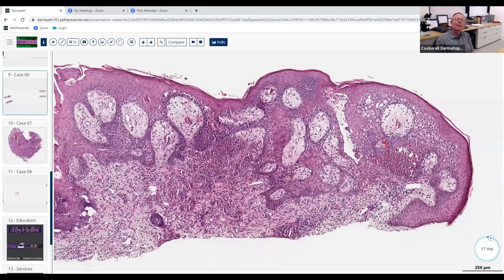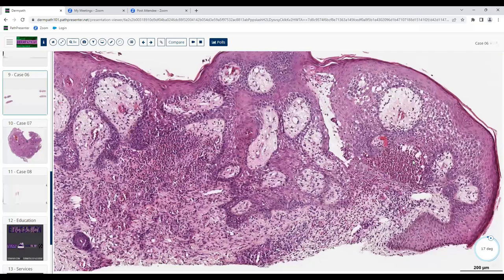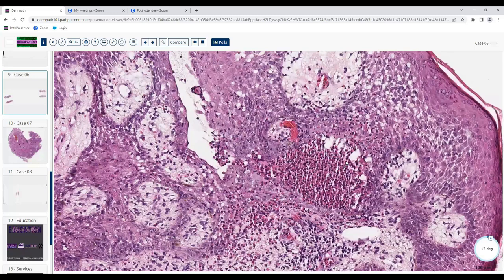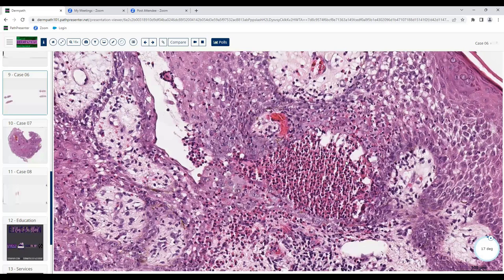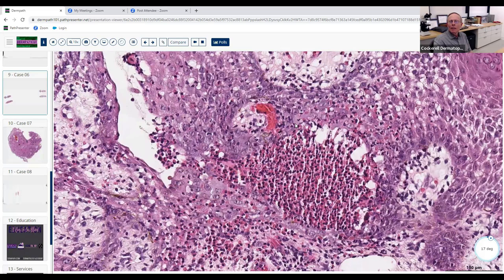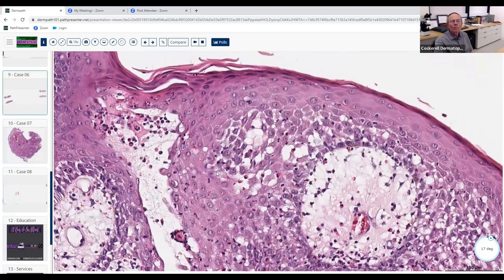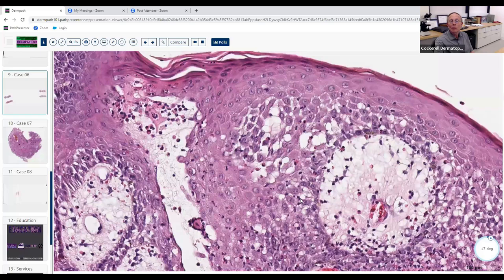So I was going down the eosinophilic spongiosis differential, favoring incontinentia pigmenti versus pemphigus vegetans. How would you distinguish between those two? With incontinentia pigmenti you get more dyskeratotic keratinocytes; with pemphigus vegetans you see the pseudoepitheliomatous hyperplasia. Both have eosinophilic spongiosis. In incontinentia pigmenti you actually see little whorls of dyskeratotic keratinocytes forming keratin pearl-like structures — which you really don't see here.